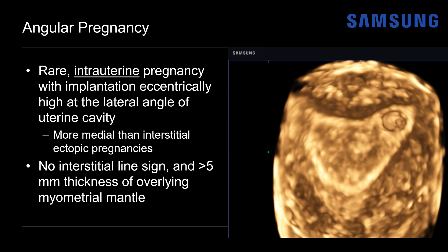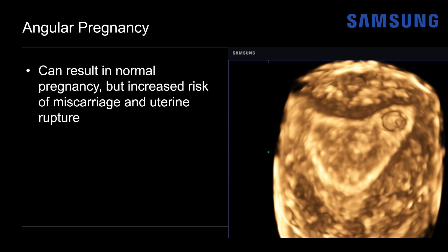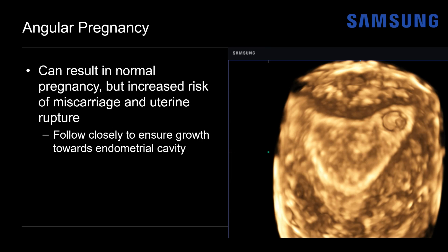Notice that this angular pregnancy is more medial in location. As we saw on the cine images, we will not see an interstitial line sign and there will be more than five millimeters of myometrial thickness overlying. These pregnancies can be normal and result in a live birth, but there is an increased risk of miscarriage and uterine rupture. Unfortunately, this patient did miscarry a couple of days after the ultrasound. Regardless, these usually need to be followed closely to ensure growth towards the endometrial cavity as opposed to towards the interstitial portion of the tube.